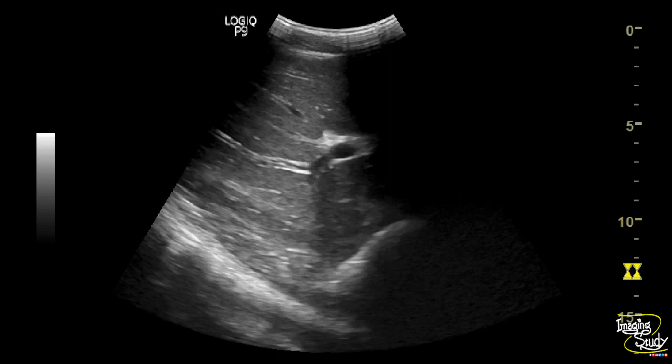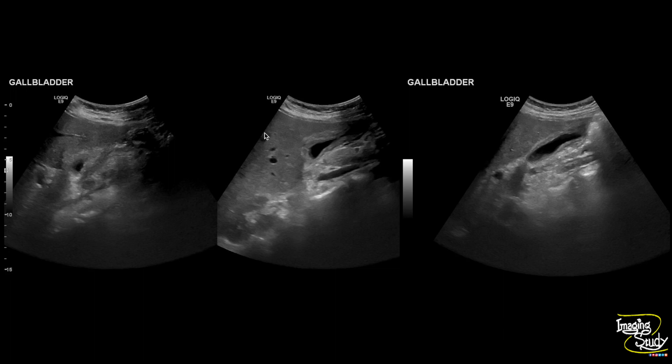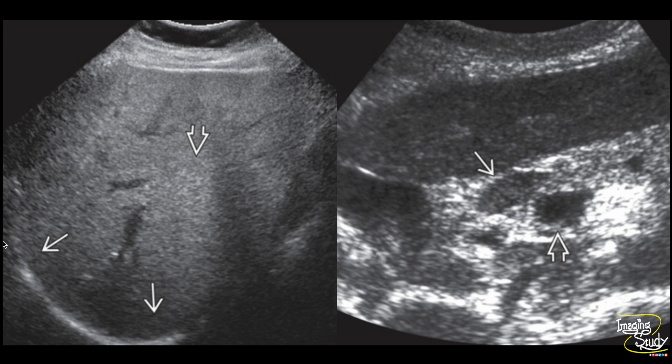Here you can see many echogenic foci indicating the starry sky appearance, and a thick-walled gallbladder in a case of acute hepatitis. The liver was enlarged, and this patient also had splenomegaly — splenomegaly is commonly seen in children with acute hepatitis. In a patient with acute alcoholic hepatitis, the increased echogenicity of the liver with hepatomegaly may cause confusion with hepatic steatosis. Sometimes lymphadenopathy adjacent to the portal vein is seen in patients with viral hepatitis.